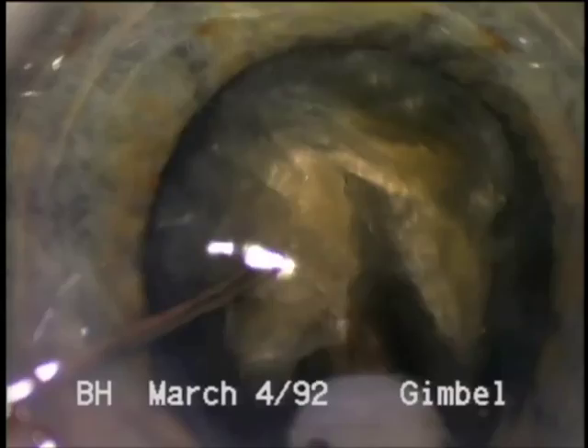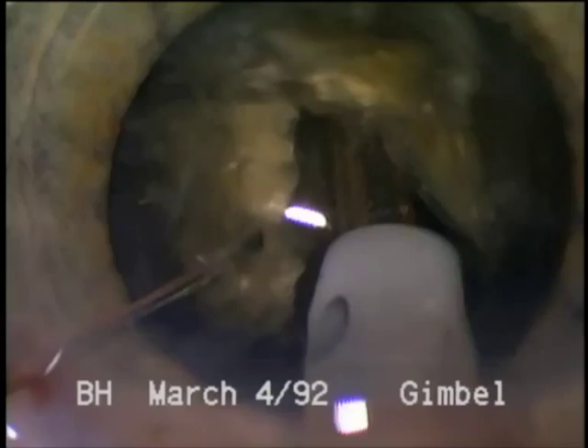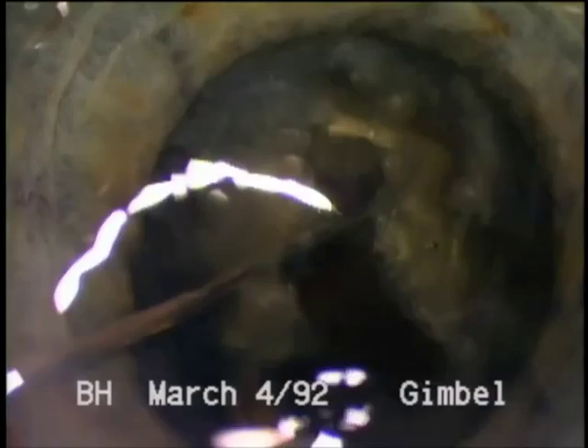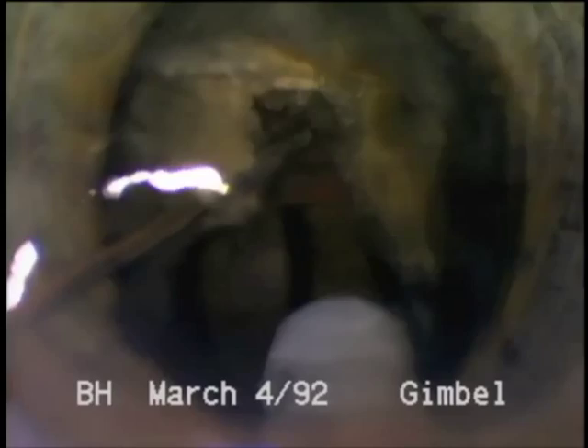This very dense brunescent lens with light perception vision only and no red reflex will illustrate these techniques. This case requires 8.4 minutes of FACO time, but only 2.85 minutes of accumulated energy, indicating about 30% average power used.